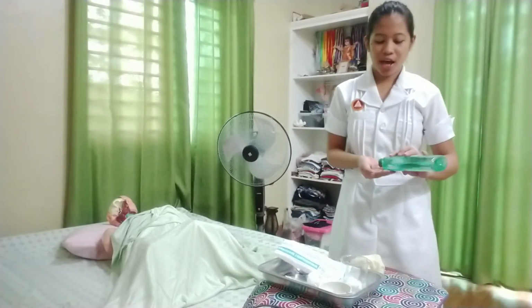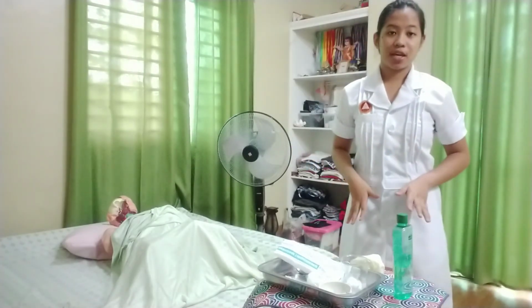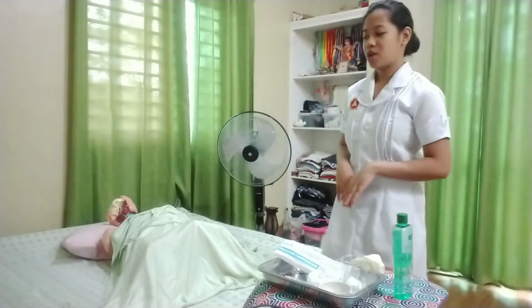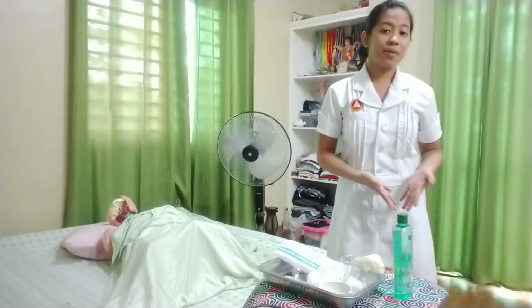And then after that, we will proceed to the documentation and evaluation, in which I will be documenting the time the catheterization was done, the amount of urine removed, and the description of the urine. I will also be documenting the reaction of the patient to the procedure. So that's all for the catheterization of female and male urinary bladder using an indwelling Foley catheter.